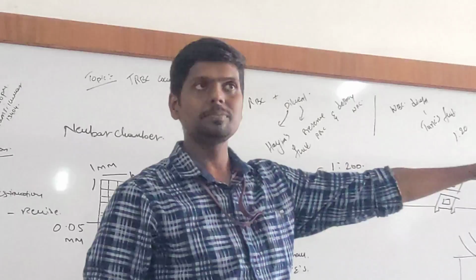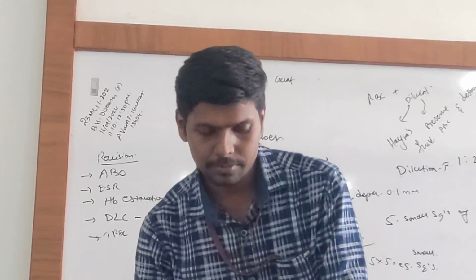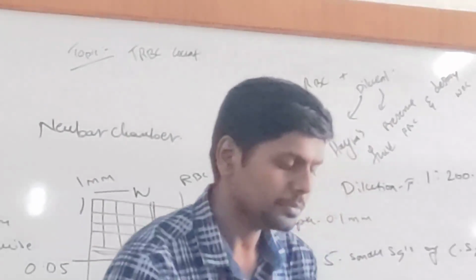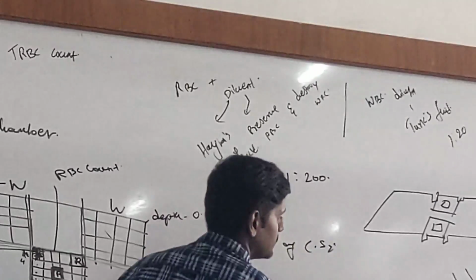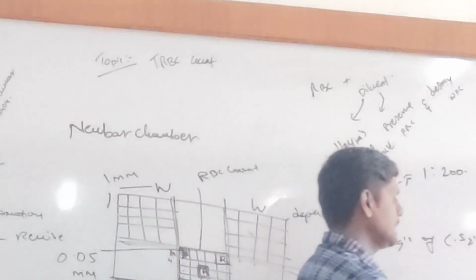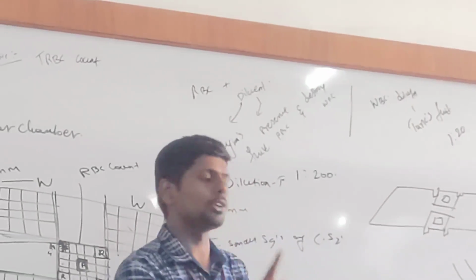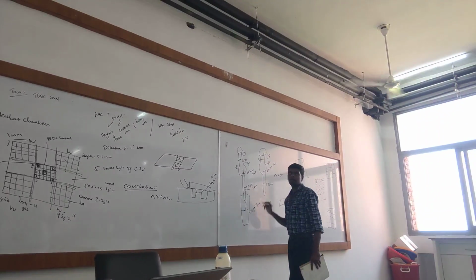After counting the cells, you need to apply a formula. Write down the calculation now, everyone. RBC calculation. Calculation for RBC count. Very important. So, in a nutshell, the calculation goes like this: n into 10,000. Simple. This is the final step of calculation, keep in mind. N into 10,000 for RBC, whereas for WBC, this is n into 50. Keep in mind.